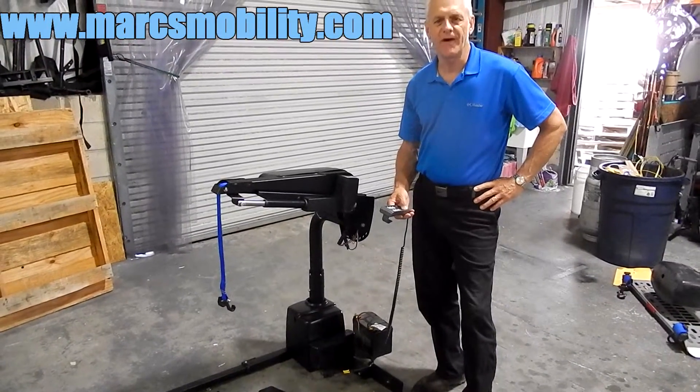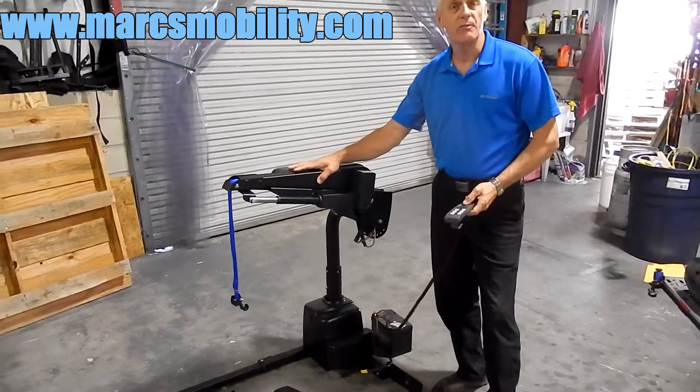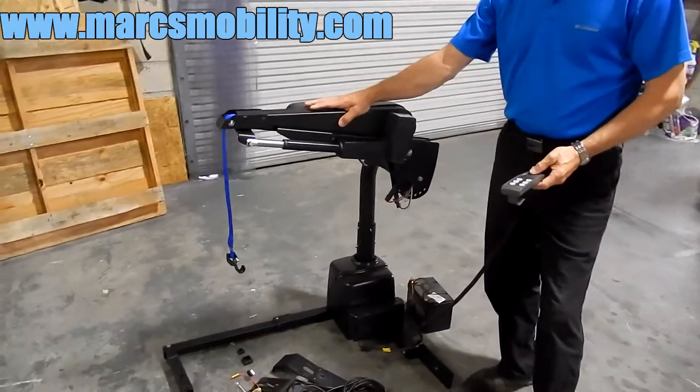This is a Harmar AL 435 AXS III Power Lift. This power lift has a 400-pound lifting capability. This is one of the best lifts on the market.